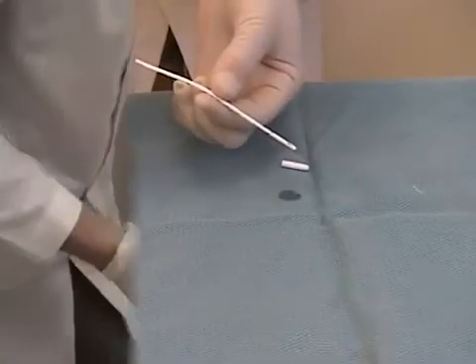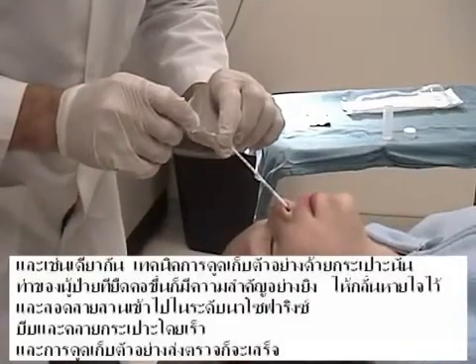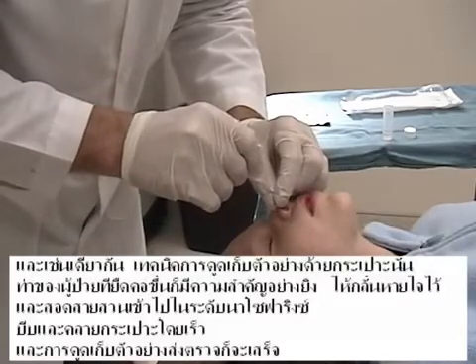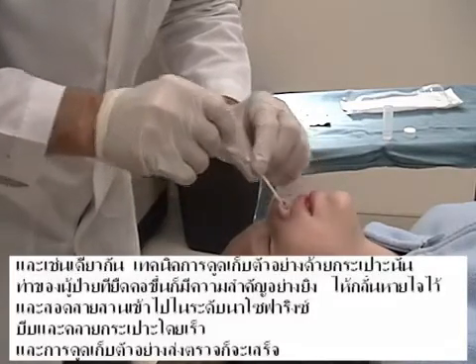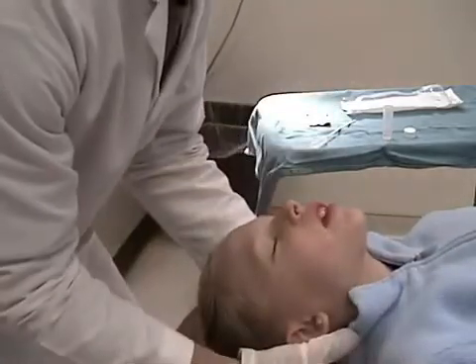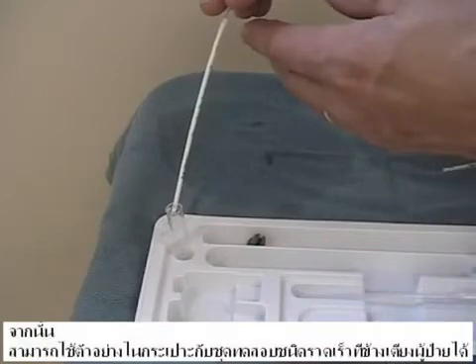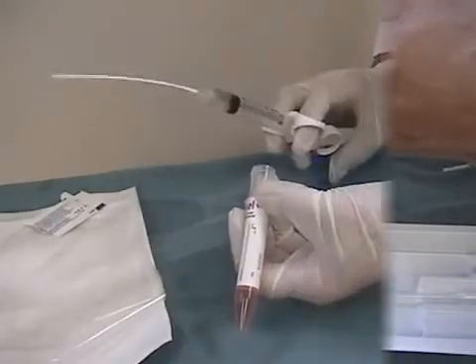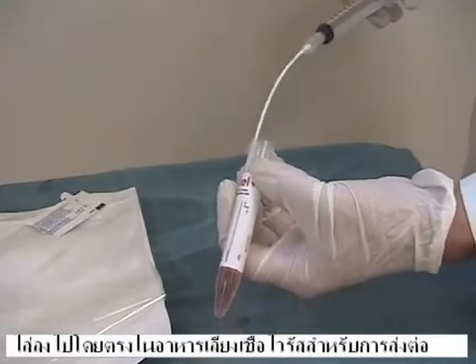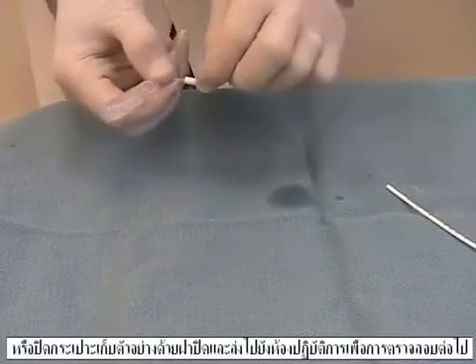The volume of saline needed may vary and can be expelled if necessary. With the bulb aspirating technique, again, positioning is very important with neck extension. The breath is held, the catheter is inserted to the nasopharyngeal level, the bulb quickly compressed and released, and the aspiration is done. The bulb specimen can then be used at bedside with a rapid test kit, directly into viral transport medium, or the bulb sample can be capped with the enclosed cap and sent to the lab for further processing.